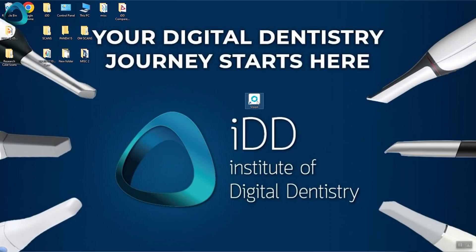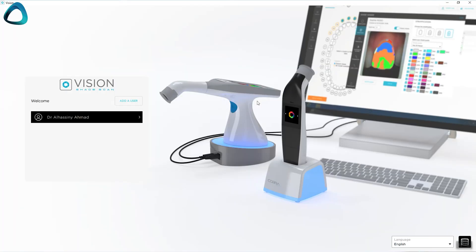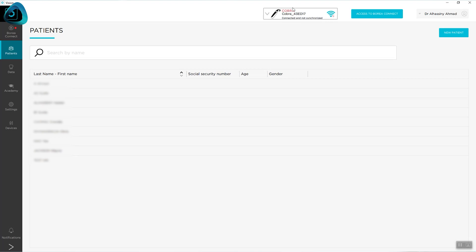One thing to highlight is that this device has digital dentistry in mind. It comes with fully fledged software that keeps records and tracks all patient shade detections, and it works in complement with intraoral scanners. This is not a scanner and doesn't compete with intraoral scanning devices — rather, a combination of this and an intraoral scanner gives us a 100% digital workflow.